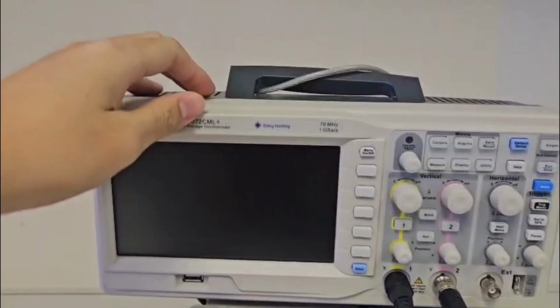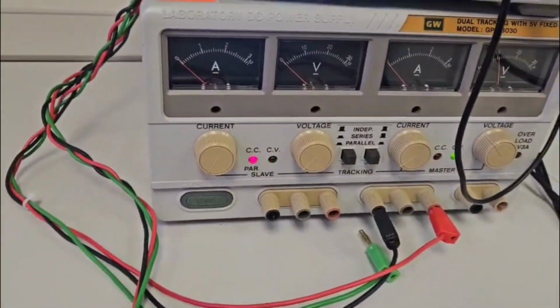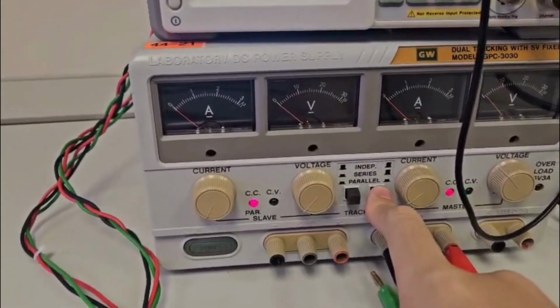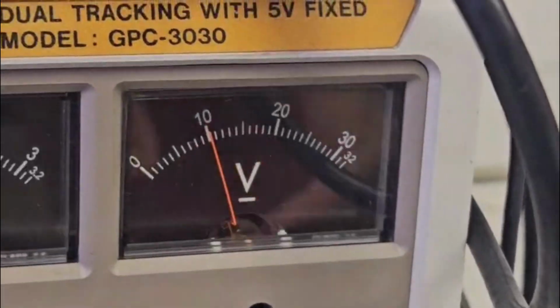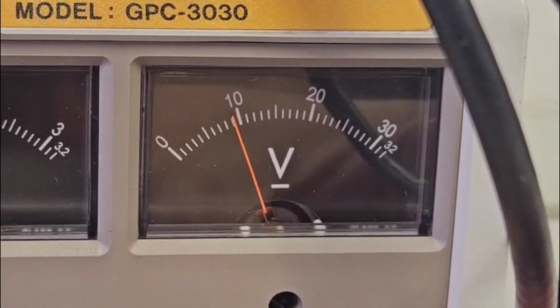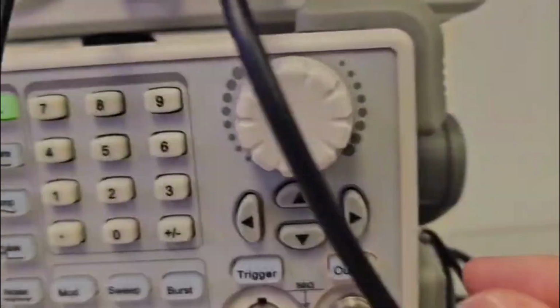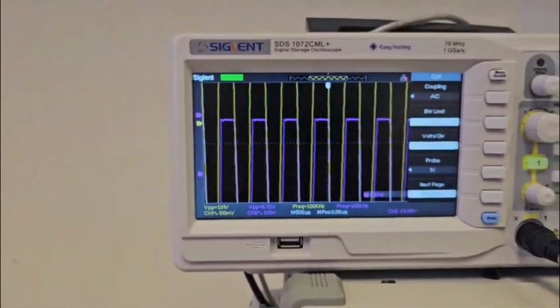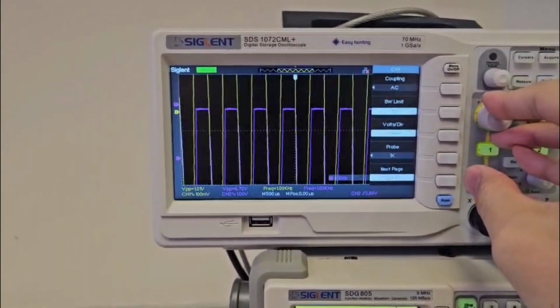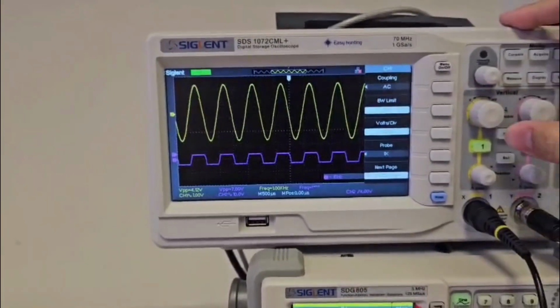So firstly, you have to turn on all the appliances. Then you have to make sure that the power supply is in independent mode, not series nor parallel. And afterwards, you adjust the voltage till it reaches 9 volts. Then you make sure that your function generator's output is turned on. Then you look at the oscilloscope's monitor, turn the knobs to adjust the size of the sine wave, and make sure it is in AC mode to get a better reading.